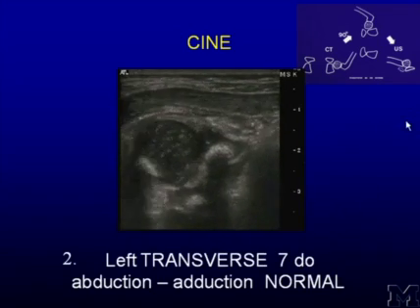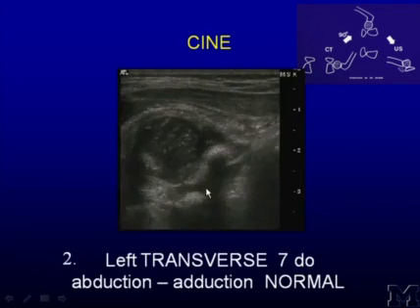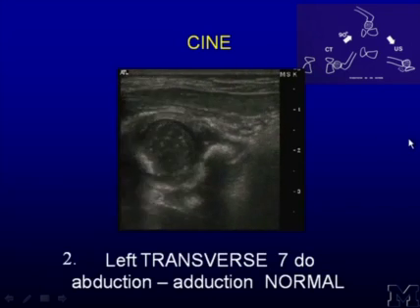Now we're switching to the transverse view, kind of like the CT scan, and now I'm just doing some abduction and adduction.